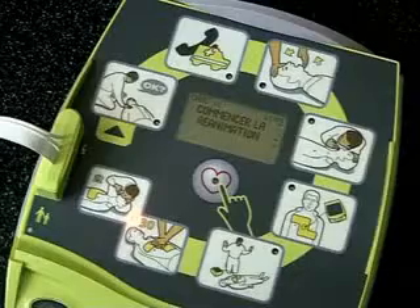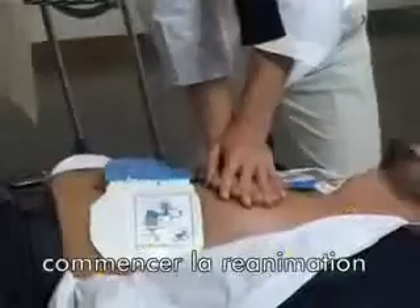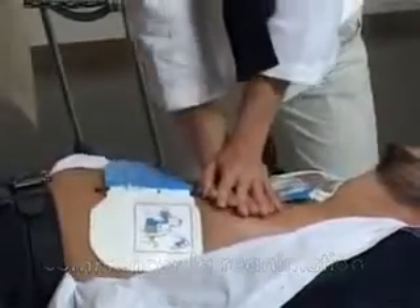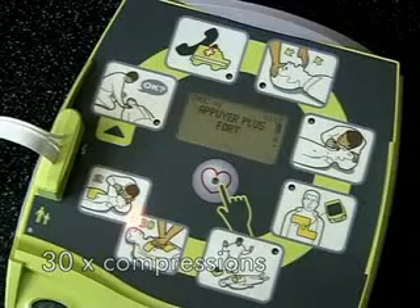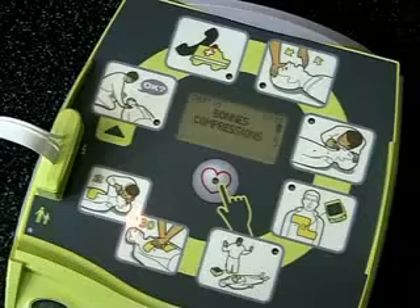Commencez la réanimation. Appuyez plus fort. Bonne compression.